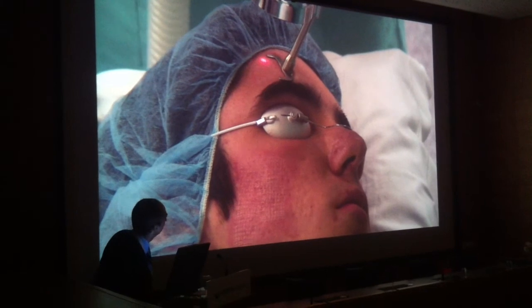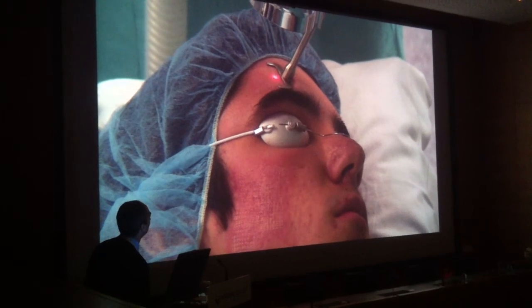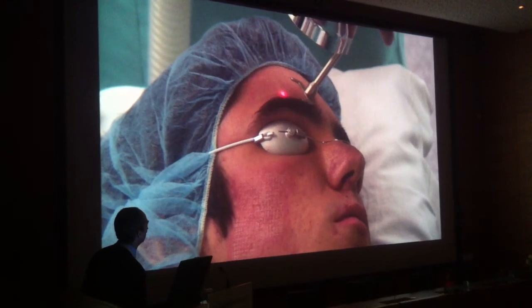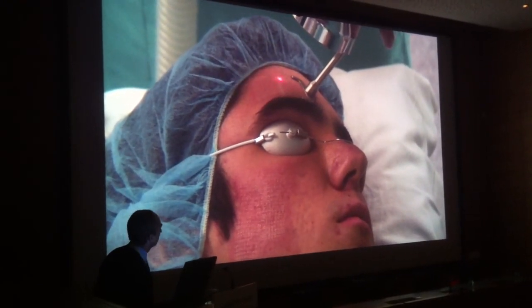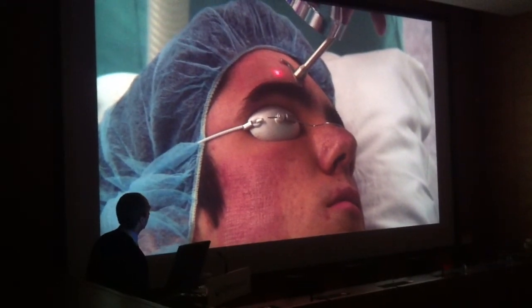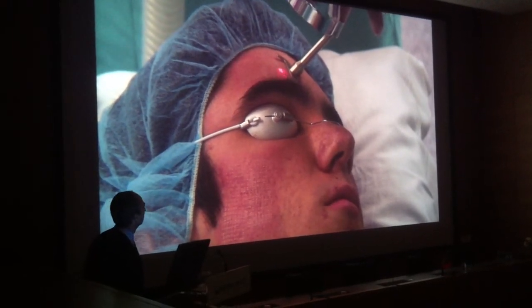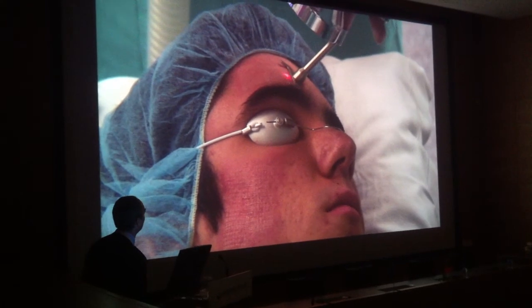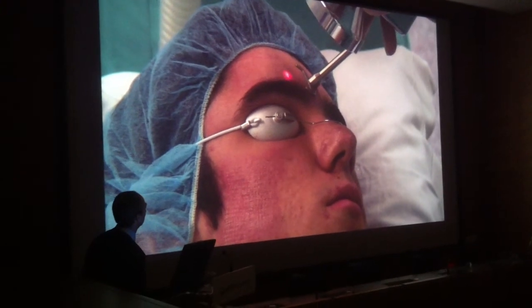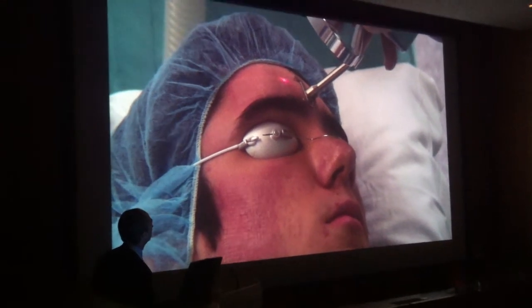You doubled the density. Yes, I've doubled the density in order to grant a more uniform heating, because here, having lowered the coagulation power, I'm going to have less bulk heating in the papillary and reticular dermis. I'm not sure the heat will reach that down. So another way of doing it is increasing the density, or increasing the number of passes, so that the heat bubble beneath each little ablation can be confluent and give me a three-dimensional heating of the superficial layers of the dermis.